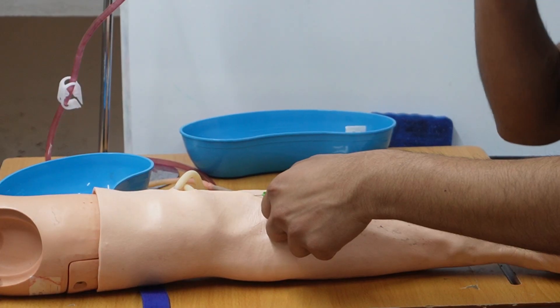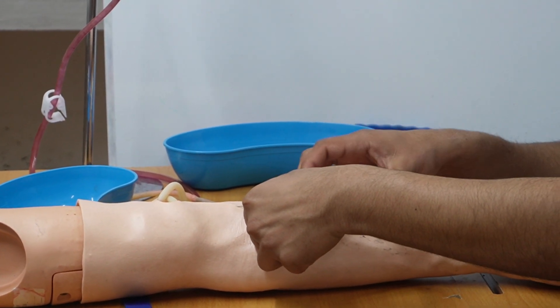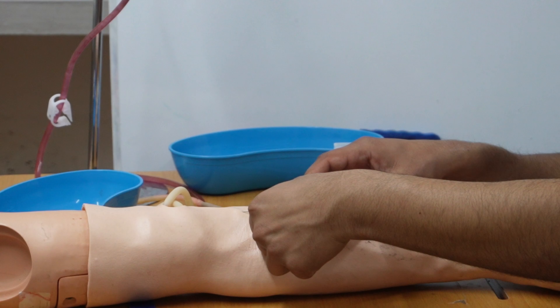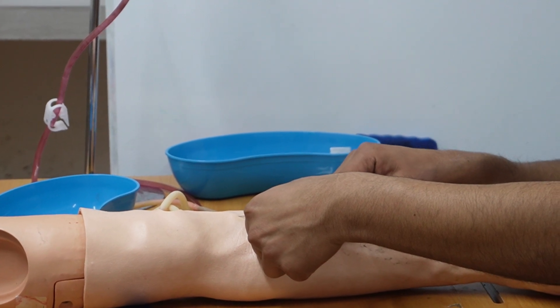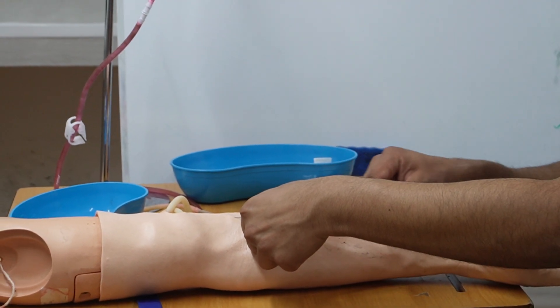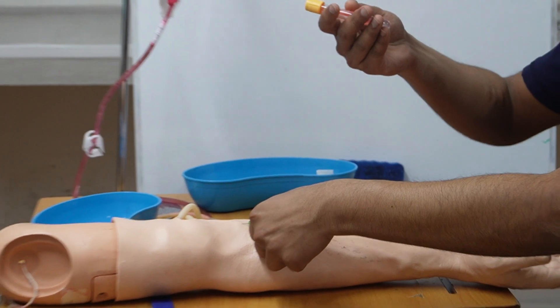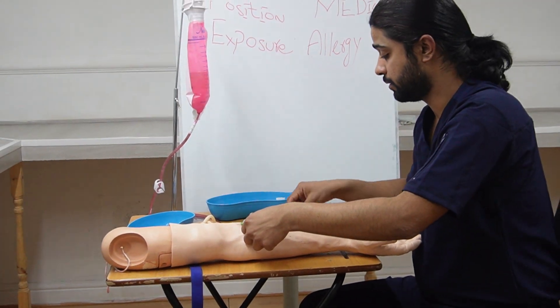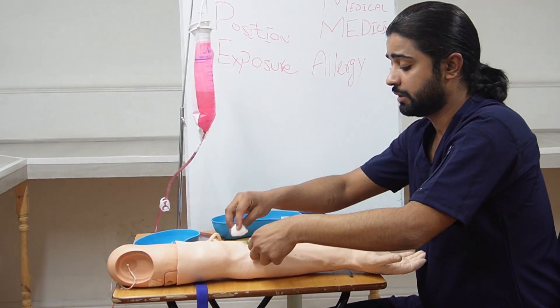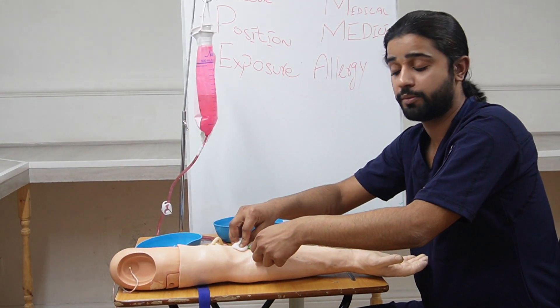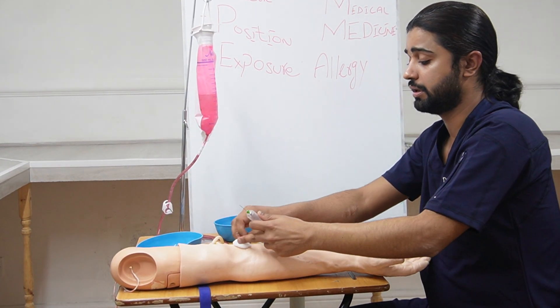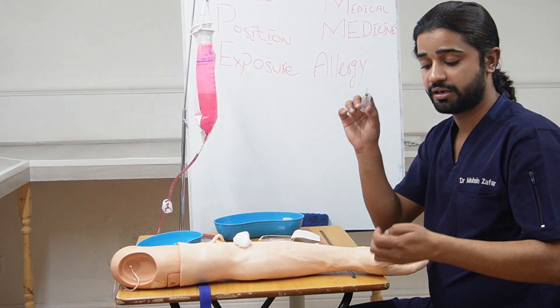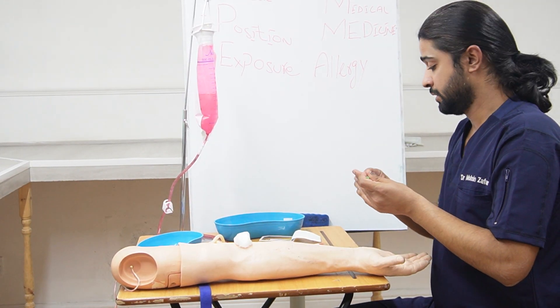Loosen the tourniquet, take the blood tube and insert it — blood will start coming. After that, take it out and rotate it 180 degrees. Then take the needle out, let the patient know you are removing the needle, and ask the patient to press on it for one minute.